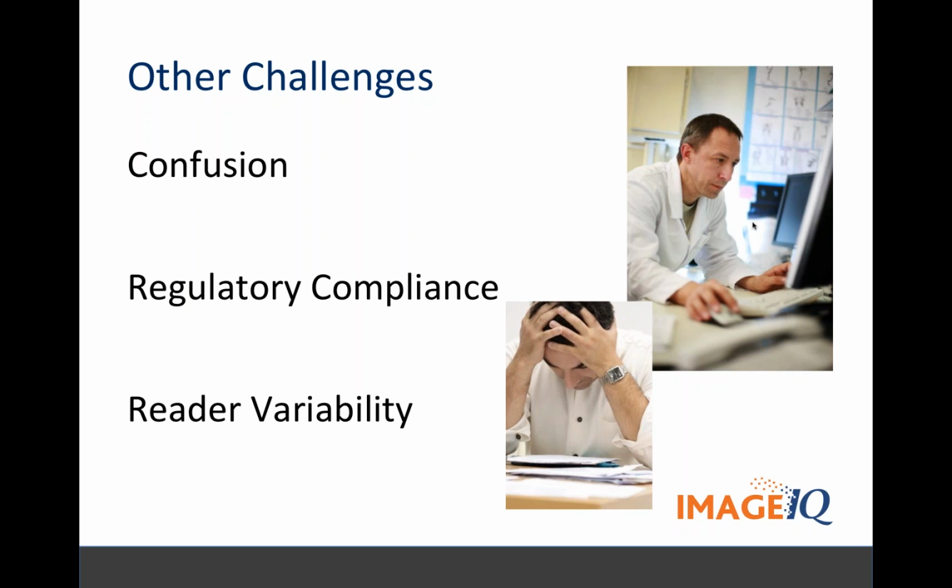Well, and a lot of folks who do the reading for clinical trials, it's rare that you will find a radiology team that will read for one clinical trial, right? Correct. So on this trial, they're doing RECIST criteria. On this trial, they're doing some other criteria. Now they're getting confused between which one was which for which, and now you're ending up in all sorts of weird situations, right? I mean, that doesn't help. And the other challenge is clearly the regulatory stuff, right?